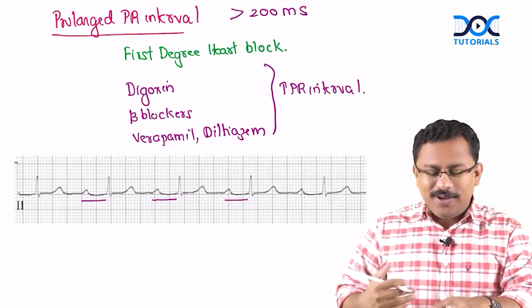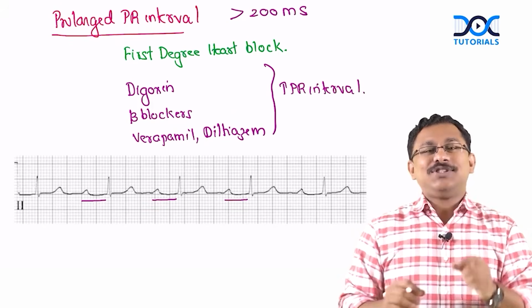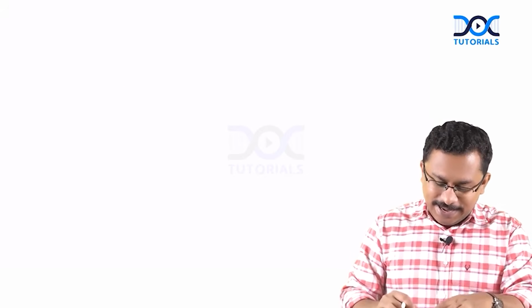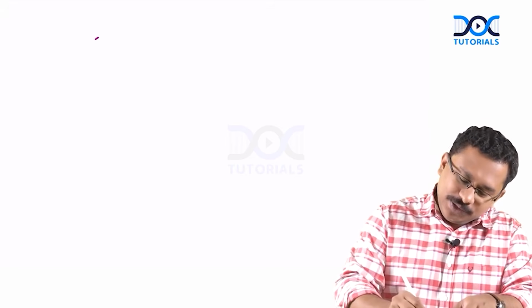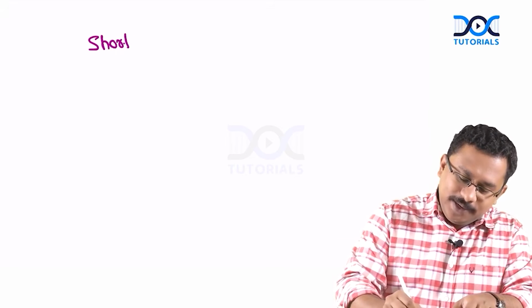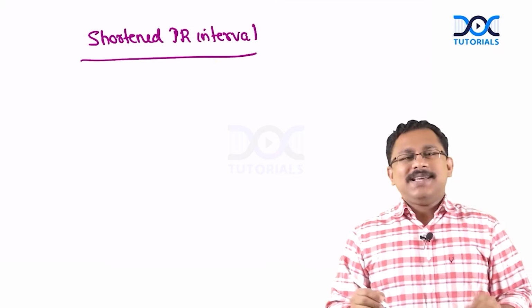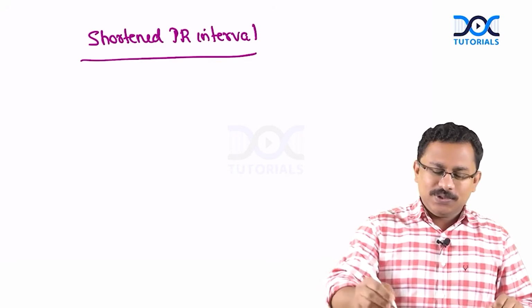Now we are moving on to the next scenario, where an individual can have a shortened PR interval. See, a short PR interval can occur in various scenarios.